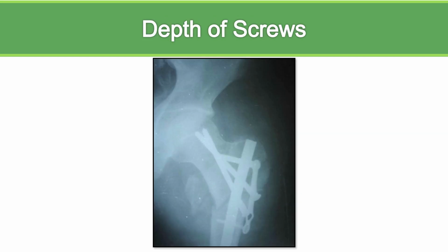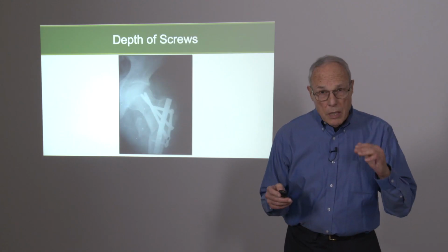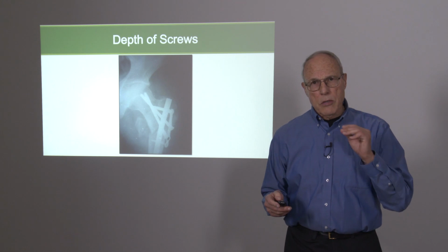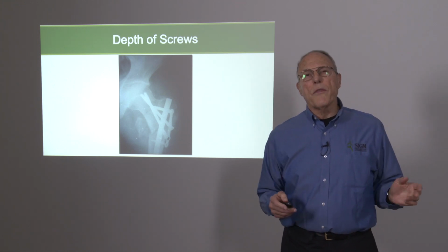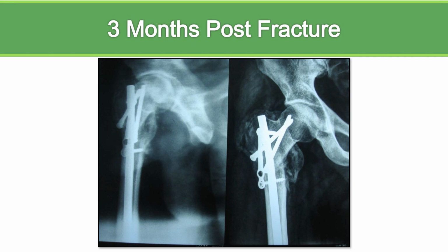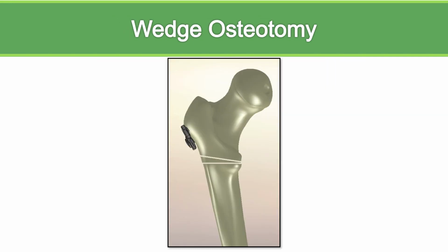This shows an intertrochanteric fracture that exits below the interlocking screw, and therefore a plate is needed. The indication for the plate in hip fractures is if the fracture exits below the interlocking screws. This fracture healed up just fine and the patient did well.